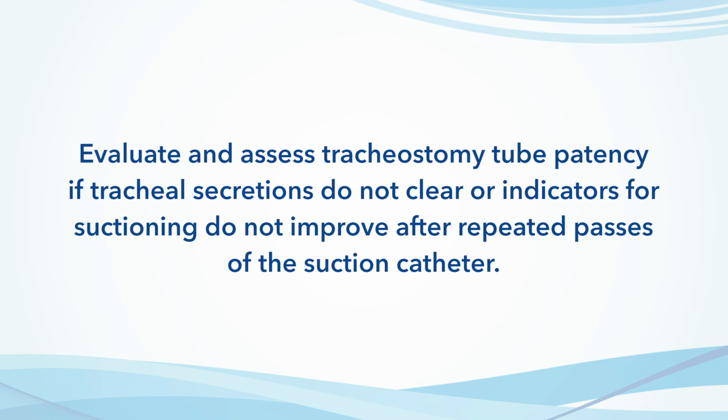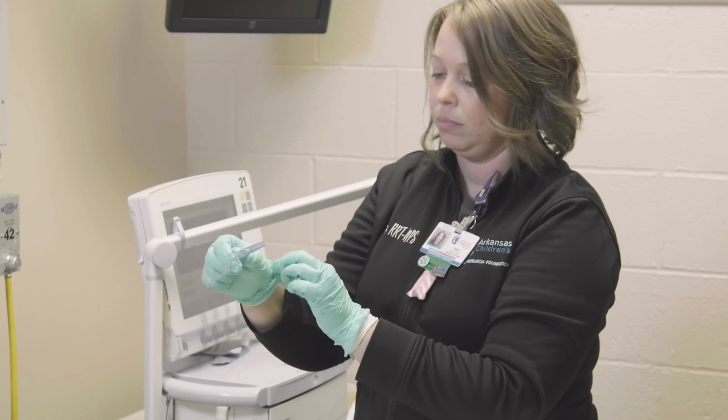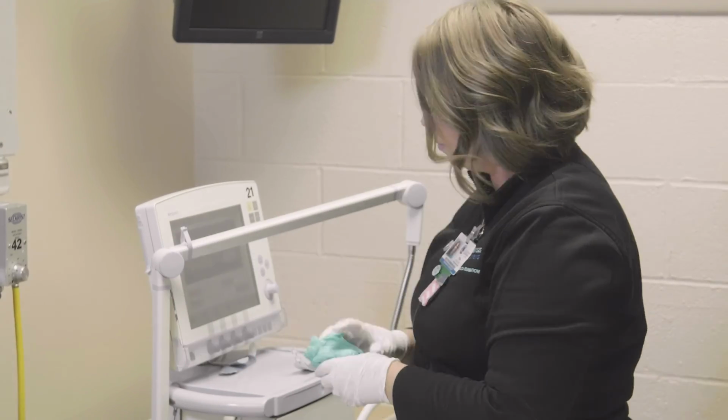Evaluate and assess the tracheostomy tube patency if tracheal secretions do not clear or indicators for suctioning do not improve after repeated passes of the suction catheter. With the catheter wrapped around the dominant hand, pull the glove off around the catheter inside out. Remove the other glove and discard it in a waste container.